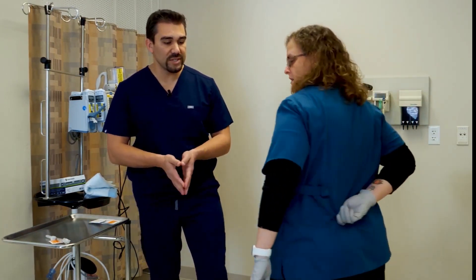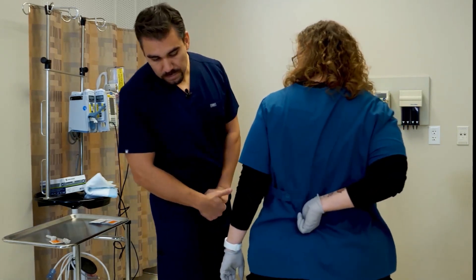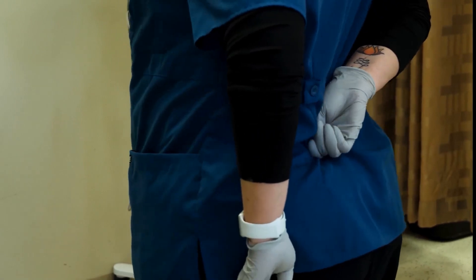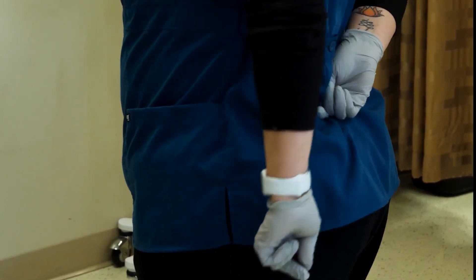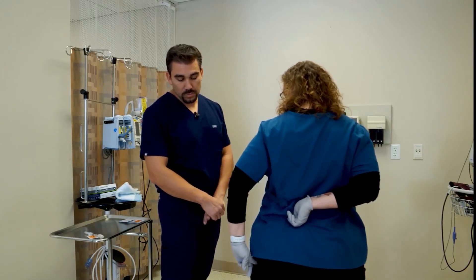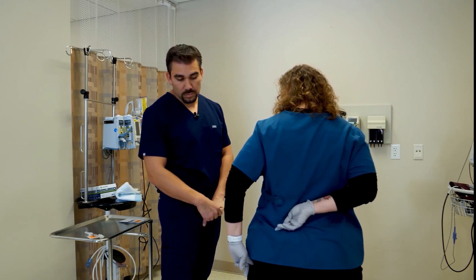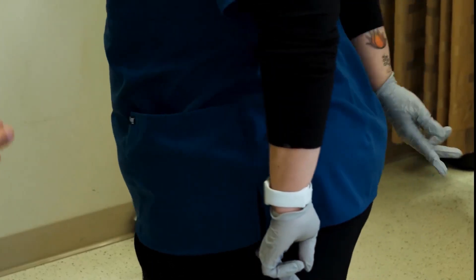We also have two glute locations. There's one that we don't do anymore, which is the dorsal gluteal. That runs from the bony prominence here to the hip — from hip bone to the round bone at the end of the spine. We don't stick there anymore. The reason is because of the sciatic nerve. Sometimes you can hit that and cause a lot more trauma.